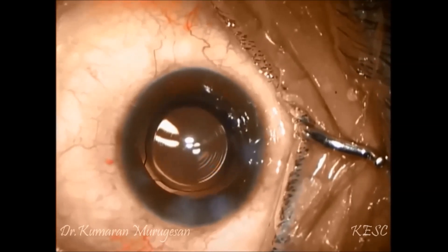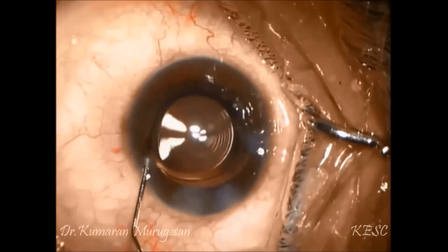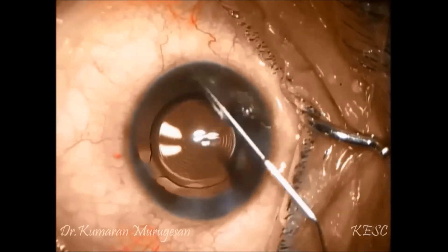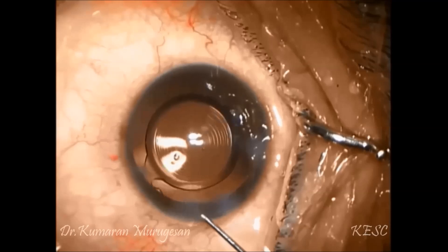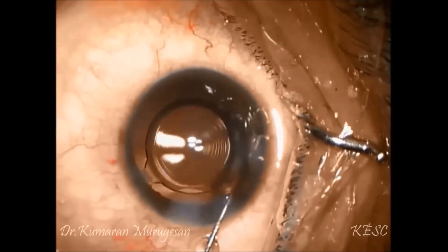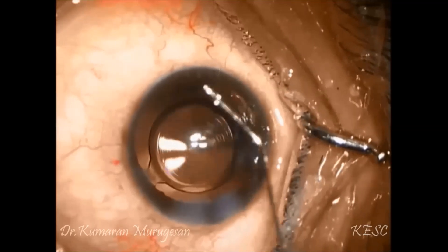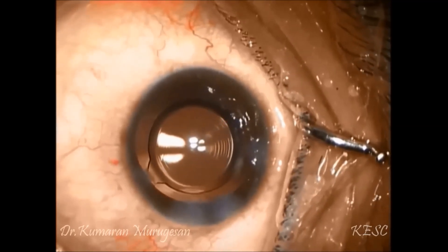These small adjustments help the surgeon to reduce troublesome glare and halos in our patients. However, when the sum of the coordinates x and y of chord length mu — otherwise known as angle kappa — is more than 0.6 mm, care needs to be taken when implanting a presbyopic IOL in these cases.